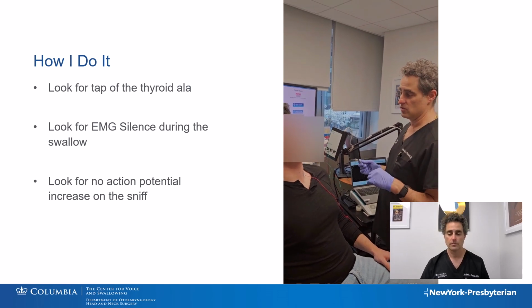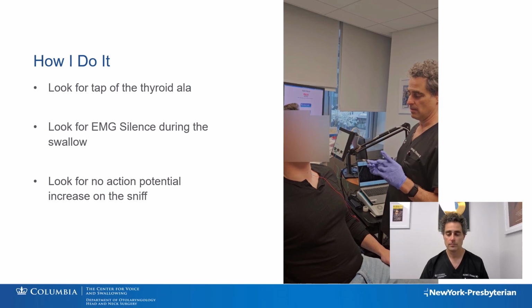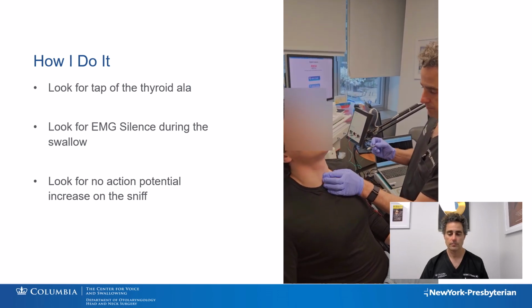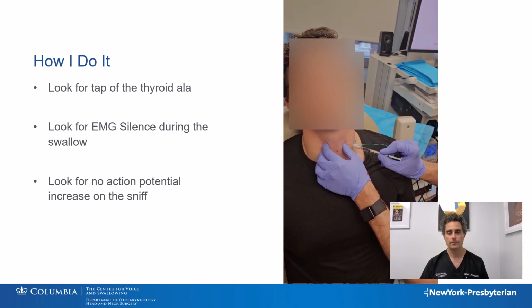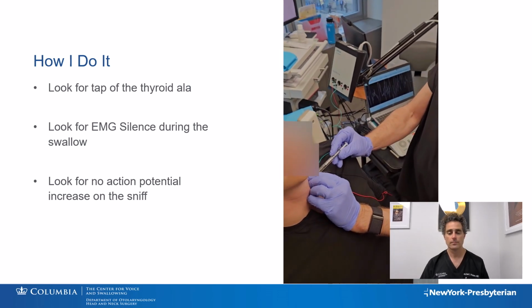All right, so we're gonna go in there. When I'm in there, I want you to just do 2 quick sniffs. Okay, so practice that like this. Perfect, and I'll probably ask you to swallow too. Okay? Pick your chin up a little bit. Good. Great. Sniff. Swallow.